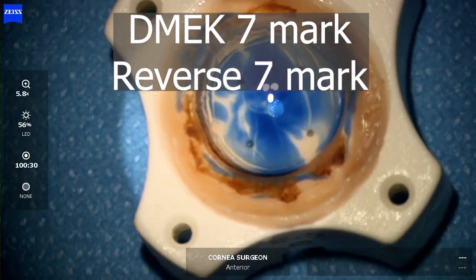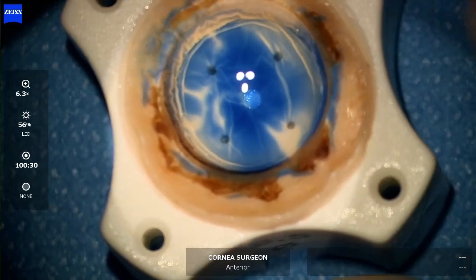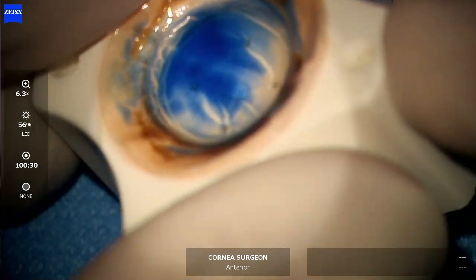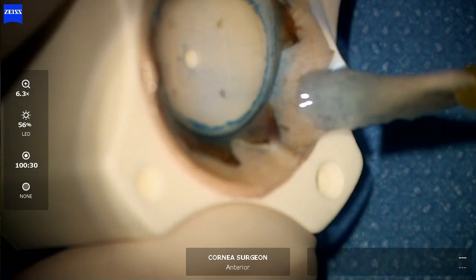This is a method to mark the orientation of a DMEK graft. Using a Simmsky hook, the edge of the graft is scored to free it away from the rest of the tissue, and then gently lifted with the tip of the Simmsky hook.